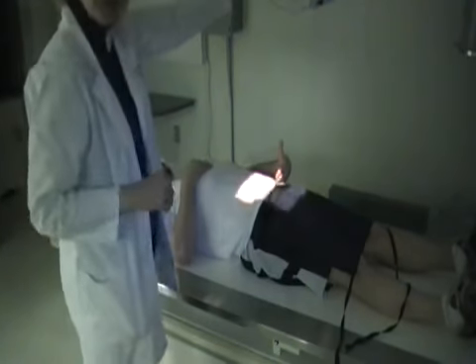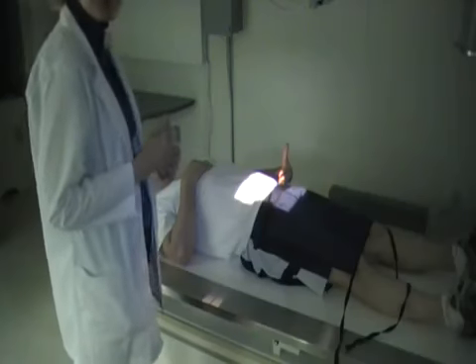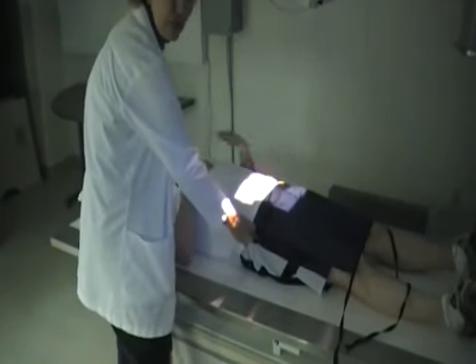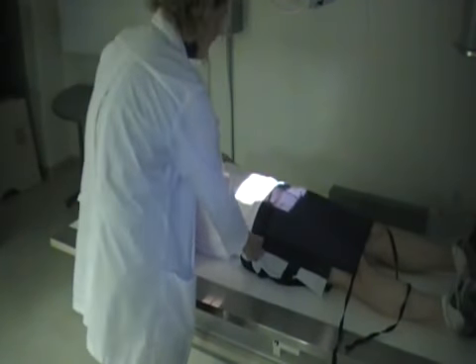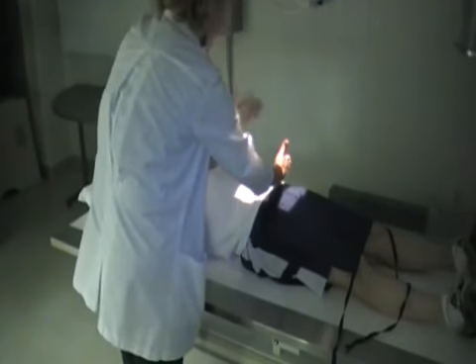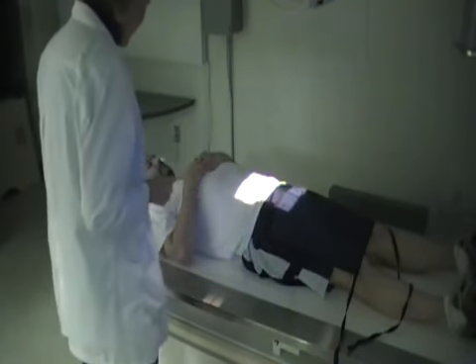Now, a lot of times you don't want to palpate down in the pelvic area. And if you recall, the pubic symphysis is also at the same level as the prominence of the greater trochanter. So if you want to just palpate the prominence here, then you can think of an imaginary line, knowing that the pubic symphysis is right at that level. Okay, so this would be the area of the pubic symphysis. So we want our central ray entering 2 inches above that. Okay, so this would be our AP axial of the sacrum.